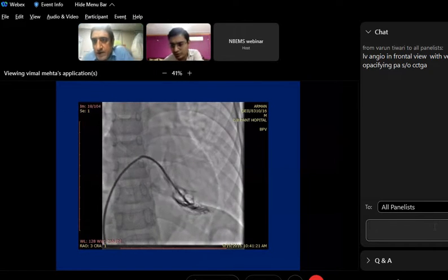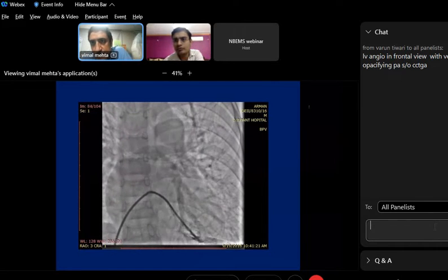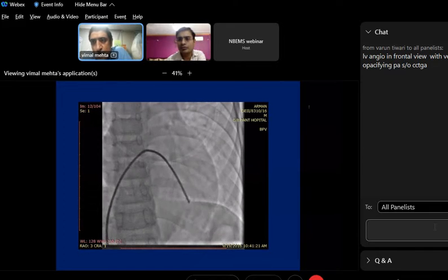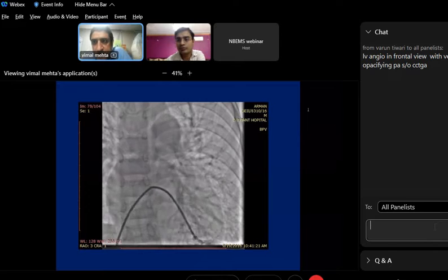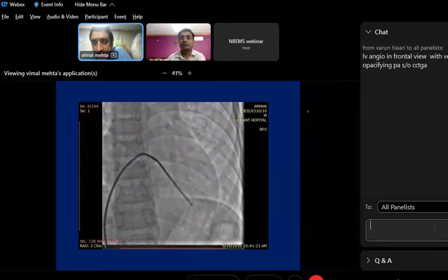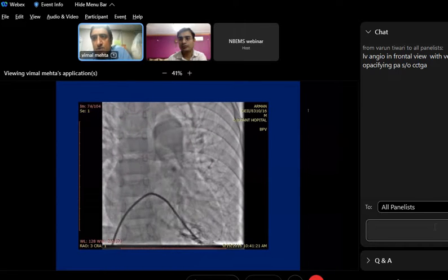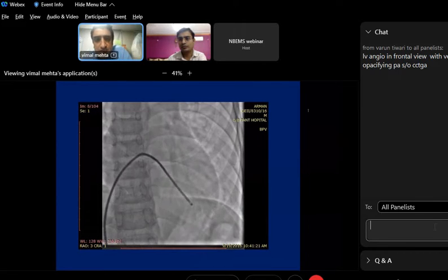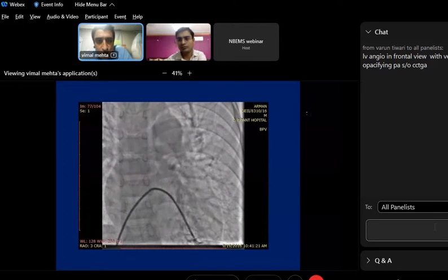So we have a few answers. Okay, actually I showed this. So very good, somebody has mentioned it. Catheter is in the trabeculated chamber and probably right ventricle. Yes, probably should always be used. Because you cannot say an RV angiogram showing DCRV. Okay, for DCRV you have to have some sort of gradient.